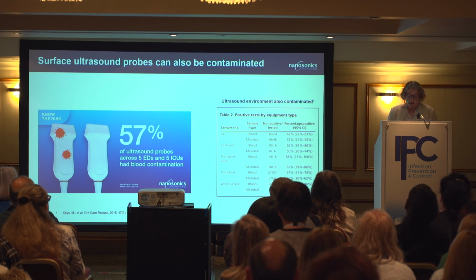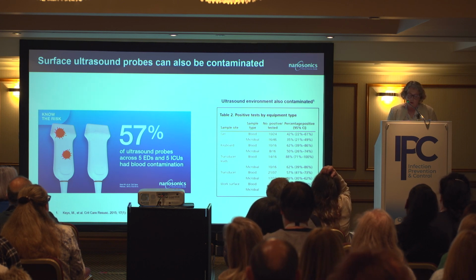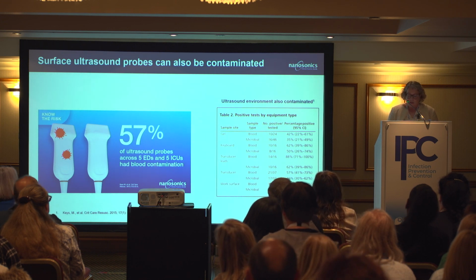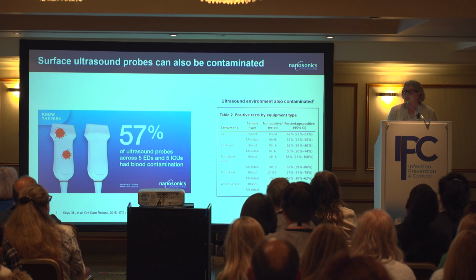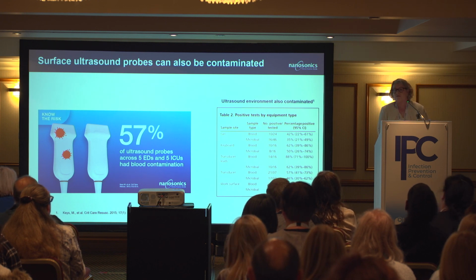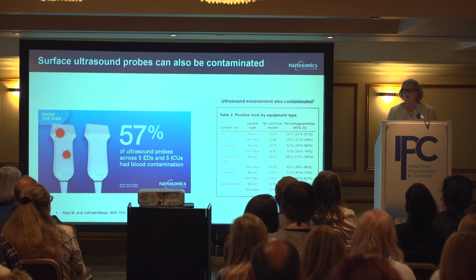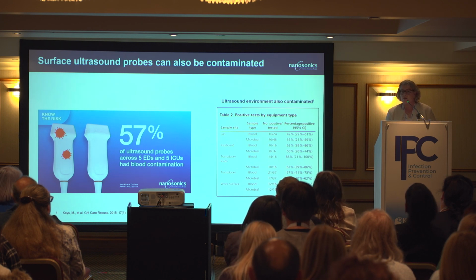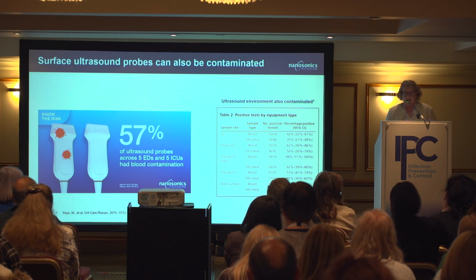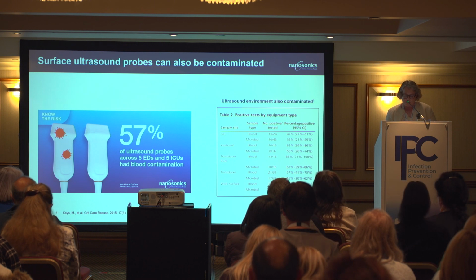They're definitely at higher risk of infection if the probes are not being properly disinfected. So every second probe that they looked at was contaminated with bacteria or blood. And even where they saw that blood contamination, only half of it was actually visible. So what we don't understand is this invisible, unknown risk with the use of probes. And I think that's where the challenge is, where people don't understand where the risk applies to them or their patients, because they can't see it. And they can't see where the contamination is.